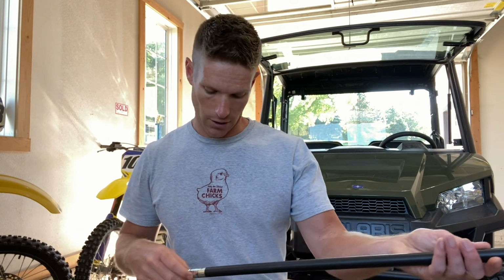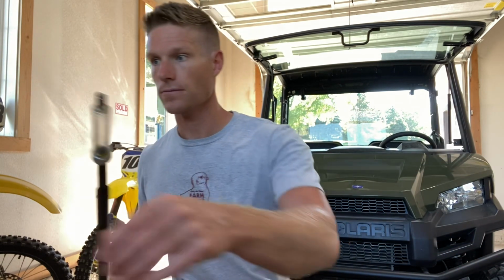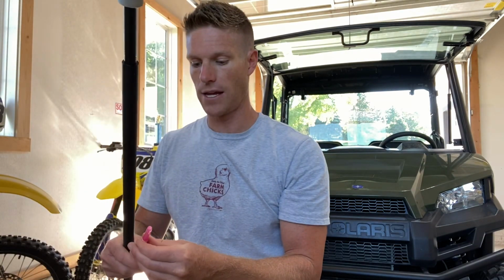It's made by Ideal, which, if you're familiar with Ideal, they make this syringe. This is stuff that you can buy at Tractor Supply or Mills Fleet Farm. Needles, syringes, a lot of the animal medication stuff Ideal makes. So it's called a Safety Flex Pull Syringe. The needle just goes right on the end.